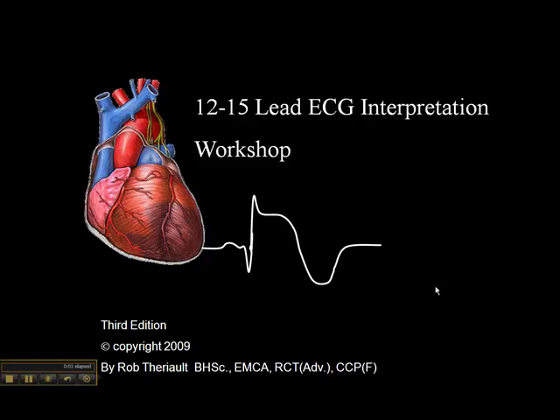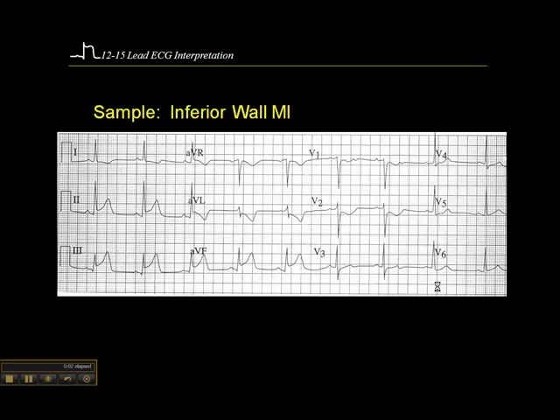We're on page 21 of the workbook, and this is an example of an inferior wall myocardial infarction. As I mentioned in an earlier presentation, it's important to go through this in a systematic way. I always start by looking at lead groupings — anatomically contiguous leads.